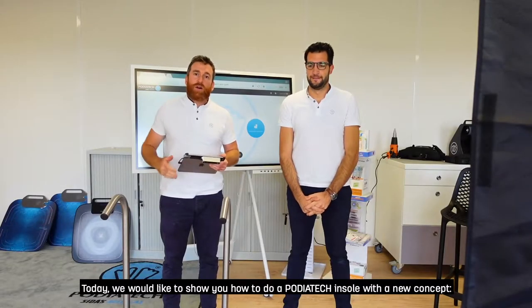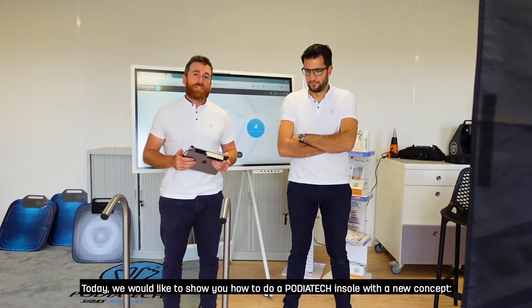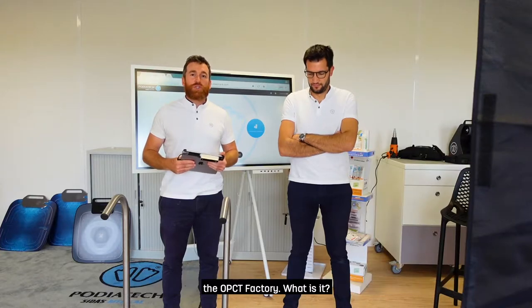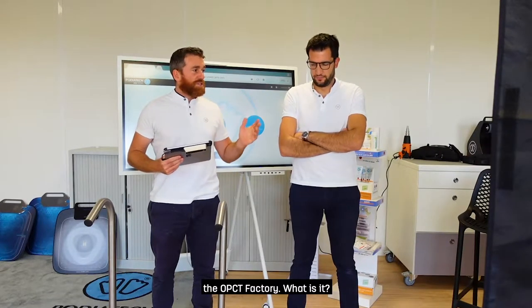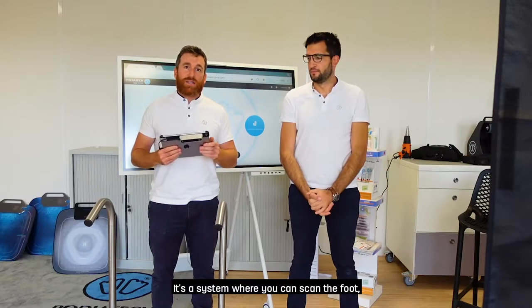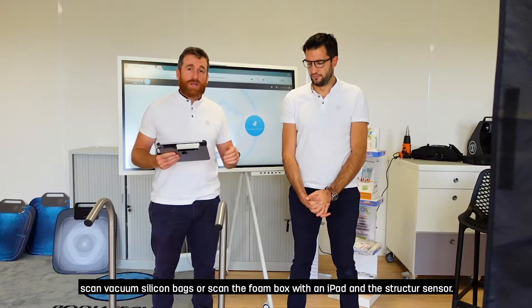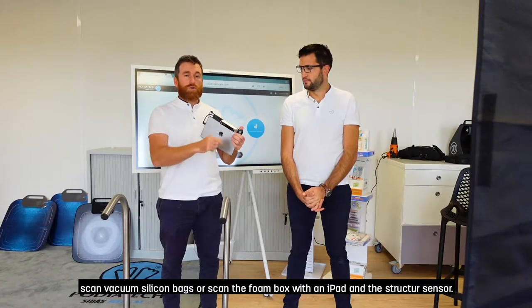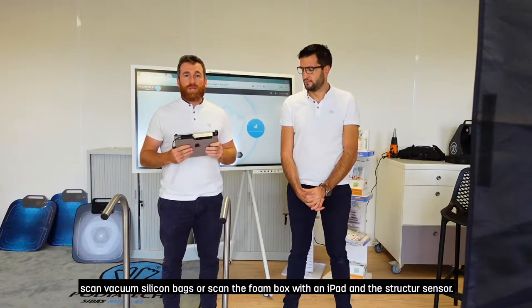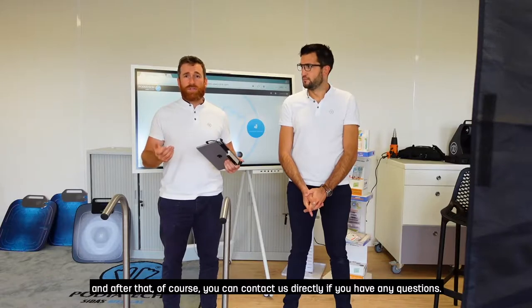Hi everyone, today we would like to show you how to do a PODIATECH insole with our new concept which is the OPCT Factory. What is the Opacity Factory? It's a system where you can scan the foot, scan vacuum silicone bags, or scan a foam box with an iPad and a Structure 3D sensor. We're going to show you the demo and after that you can contact us directly if you have any questions.